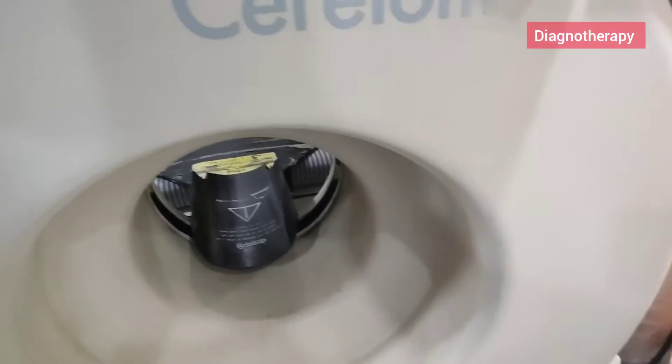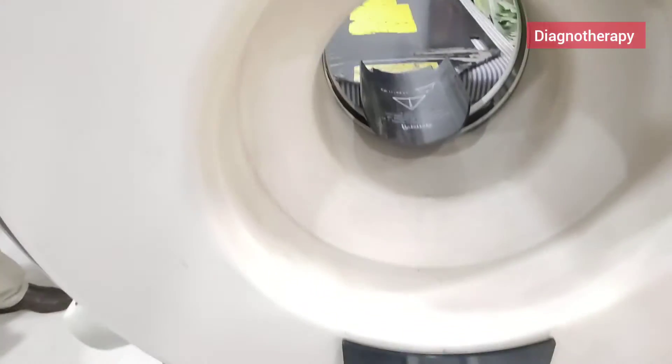For radiation protection, you can see the lead shielding in the front. It also has very much less radiation compared to the main CT scanner.